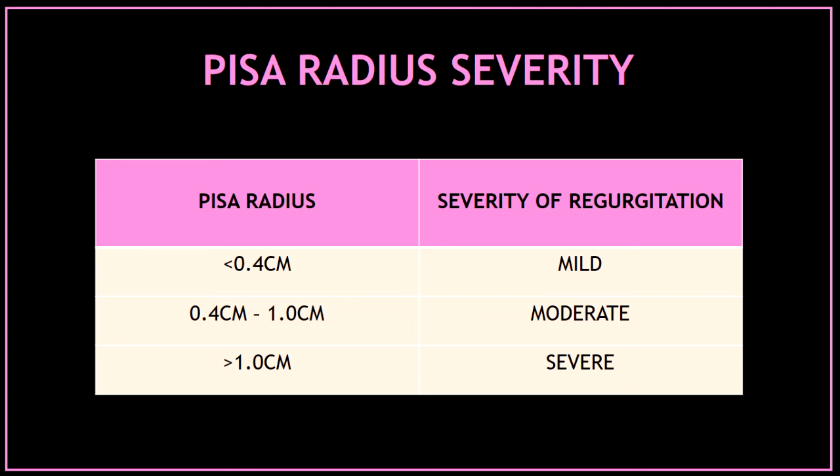And finally, I'm going to include a video of me measuring PISA. Really, this is not a difficult measurement. You just have to get used to the settings and you will see that you will do it automatically.